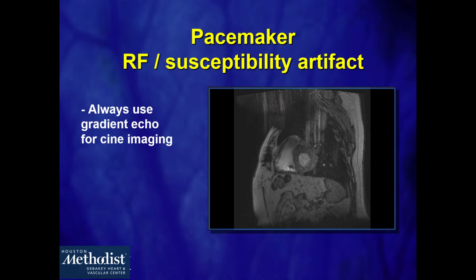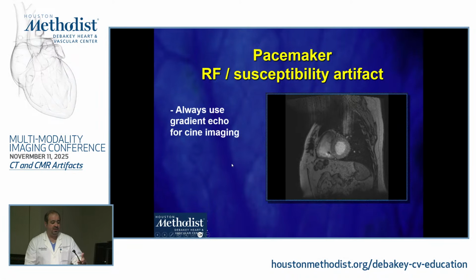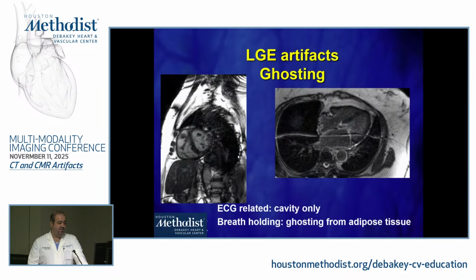And then in rare case scenarios you might want to gently see if the pacemaker generator might be pushed up against the chest. But pacemakers are safe, but the problem is you are going to go through artifacts, and this is where the tech is usually on the lookout for those, and always optimizing your image quality in order to make sure that you have a diagnostic image.